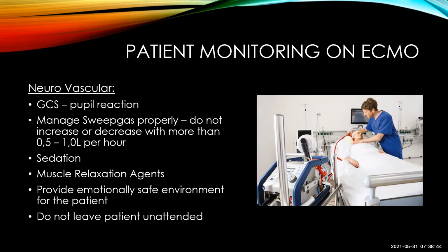So we want them to be sedated for a little while, and then you need to reduce the sedation and wake them up. So the waking up process can also be a difficult one, because they move around, they get anxious, especially if they didn't know what they were in for and they were ventilated and then went onto ECMO and they don't understand what's going on around them. And everyone tells them how dangerous this thing is and they don't want to move, and it becomes a terrible situation.